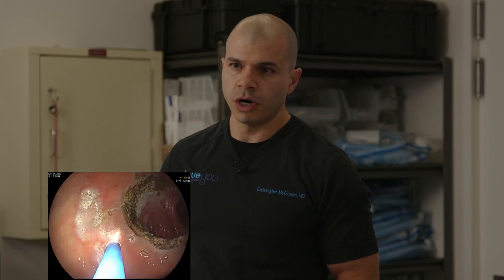So I'm using a lower wattage here. We're not going for dark brown, just a little whitening or light yellow using this device just to ablate the mucosa. And I'll suture over this later on. So slightly different settings on this device, as you can see. Going for a lighter color.